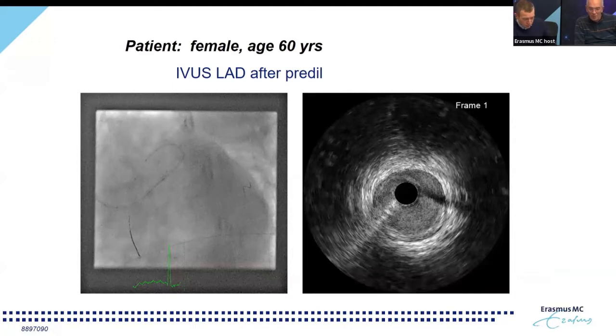And this is always very complex in case of hematomas, because typically if you put a stent which is too short, you will squeeze out the hematoma like a sausage, because this hematoma will typically not be dislodged if you don't do things like cutting or scoring balloons. Jurgen, the IVUS. So we need to play this one.